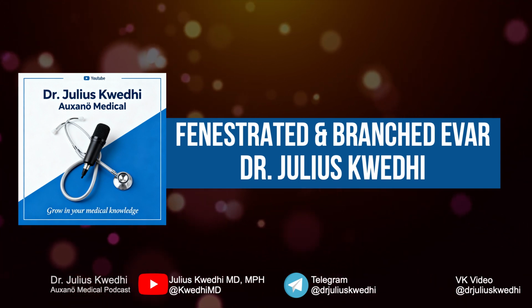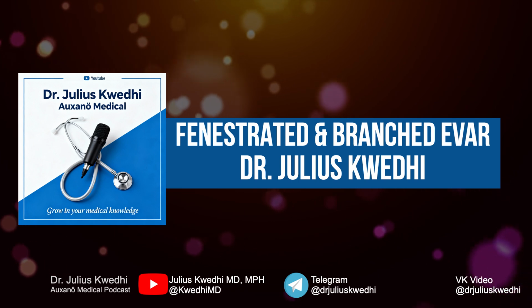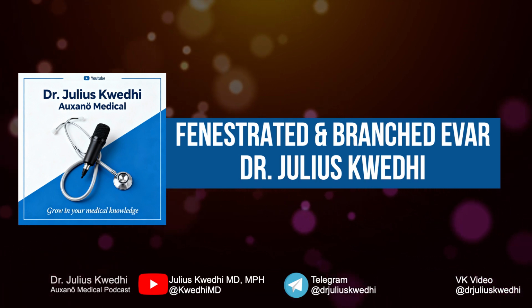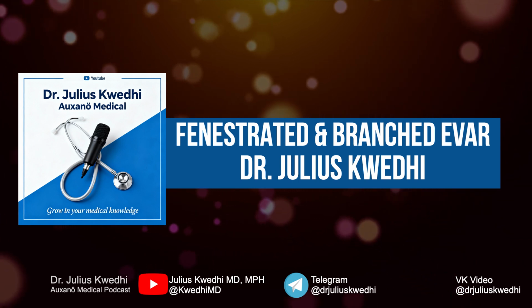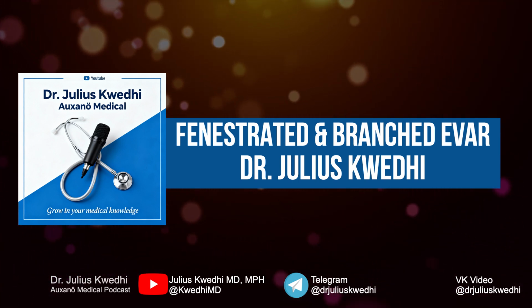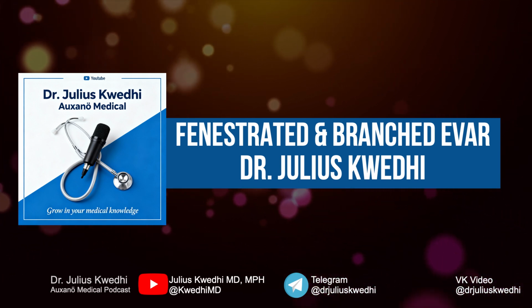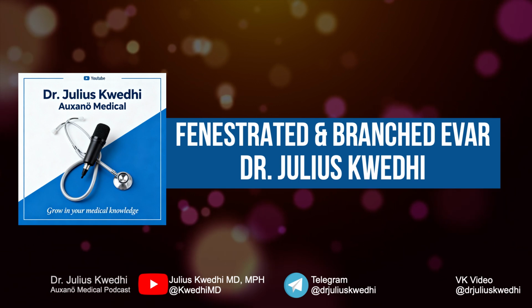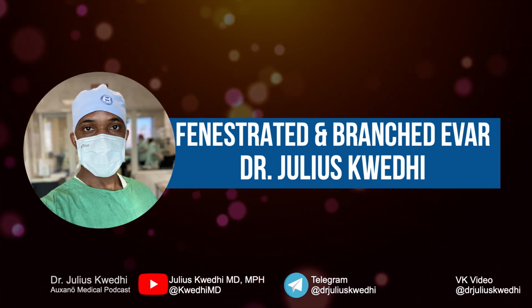As we conclude, what key clinical pearls should our listeners take away? First, recognize that 15 to 20% of aortic aneurysms have insufficient infrarenal neck for standard EVAR. Don't miss the opportunity to offer these patients fenestrated or branched repair rather than assuming they need open surgery or are untreatable. Second, meticulous anatomic planning is non-negotiable.